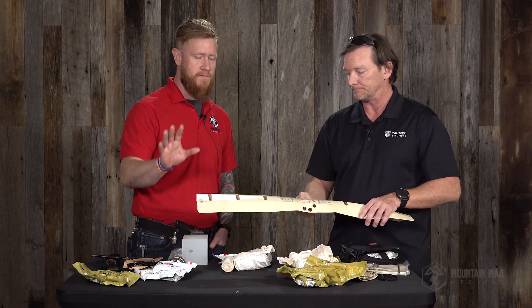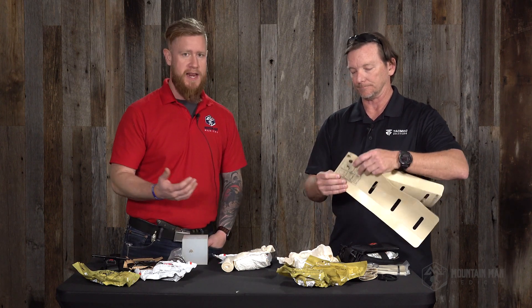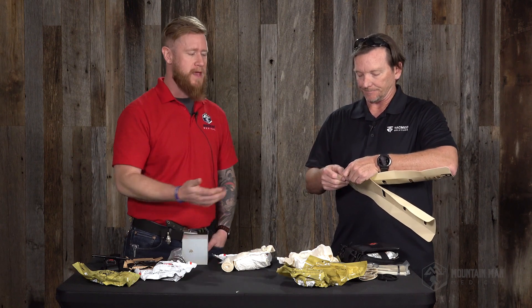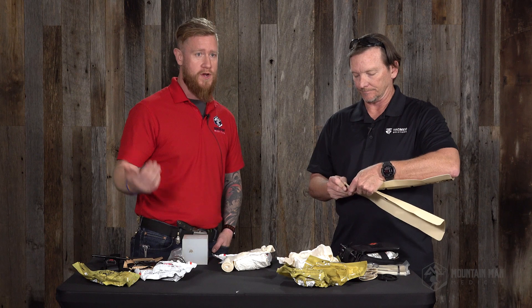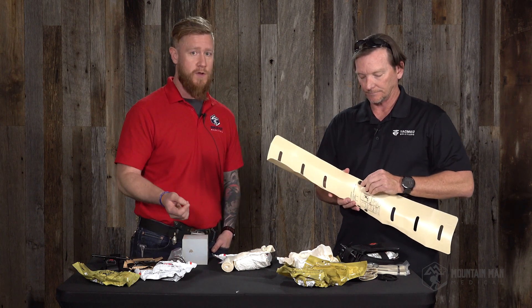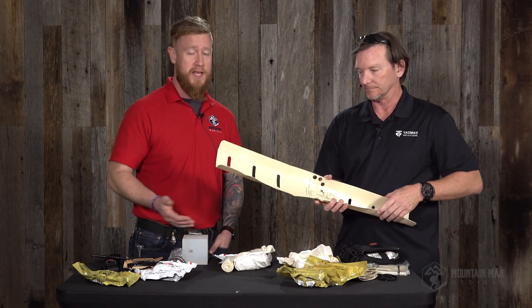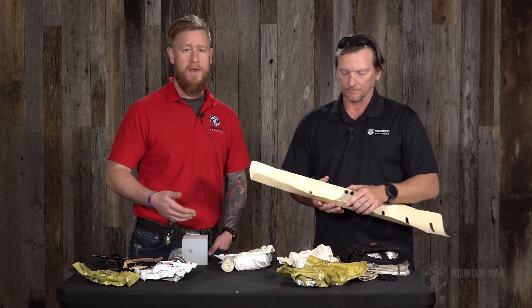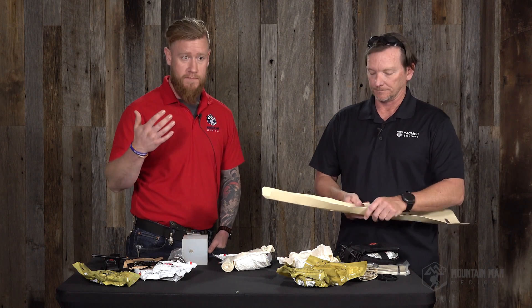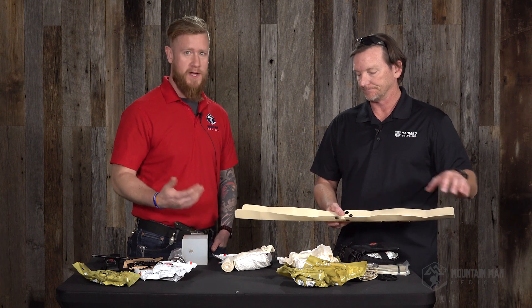Just to clarify — padding the splint is important so that you're not getting pressure spots developing over long periods of time. If you're applying this for the next half hour while getting down out of the mountains, it's probably not a huge deal. But if you're going to be there for long periods of time, you have to be conscientious of those pressure points and pressure sores developing. We want to make our casualty as comfortable as possible, so padding it with an extra layer like a jacket, coat, or another shirt from your bag will help the casualty out.